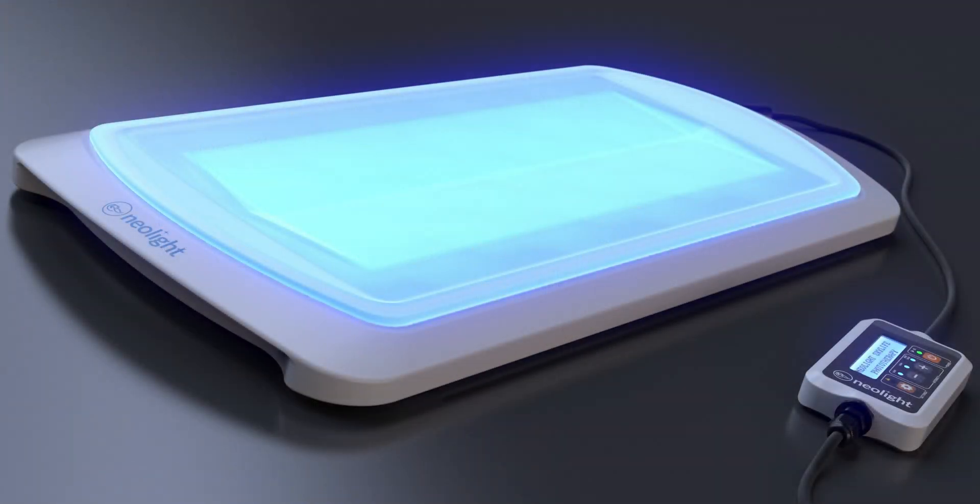When removing the Skylife from its package, please ensure that you see these primary components: the Skylife phototherapy unit and controller with power supply. You should have also received a few cloud covers and eye protection for your baby with the Skylife phototherapy system.